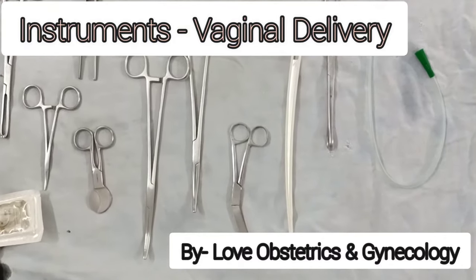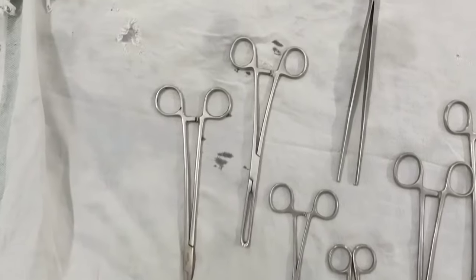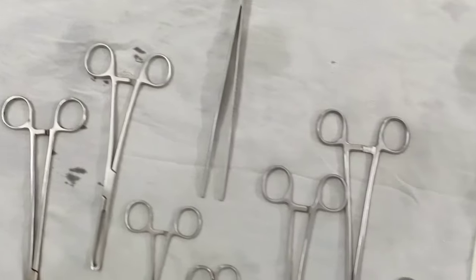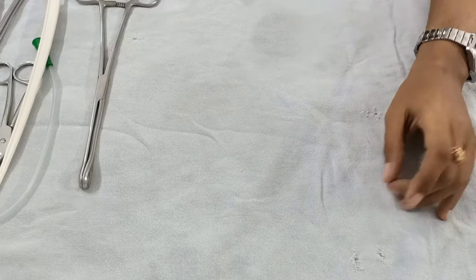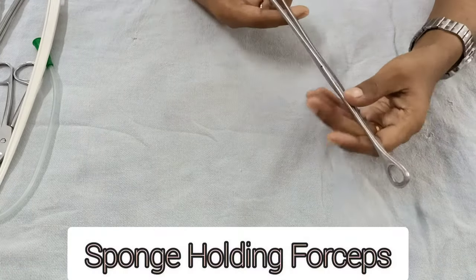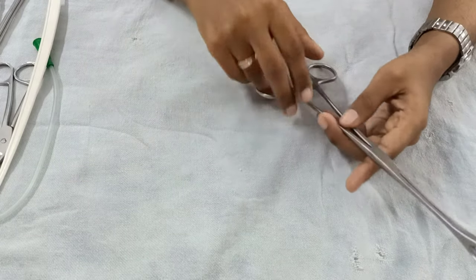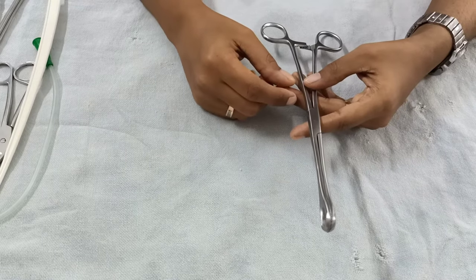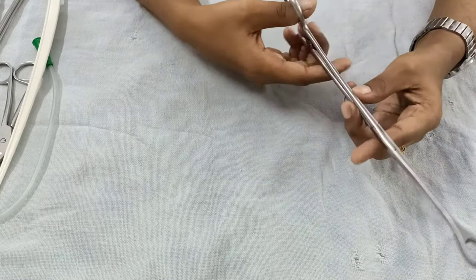Hello and welcome to the channel Love of Obstetrics and Gynecology. In this video I'll explain the instruments that you require for a vaginal delivery. The first one is a sponge holding forceps, which is required to clean the perineum of the patient or the vagina/vulva area.